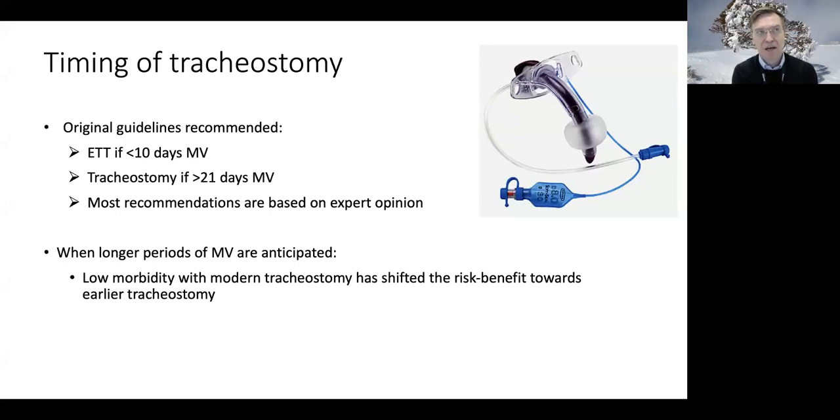And I think our practice has come to reflect that this is really a very individualized consideration for the patient that you're actually caring for at the time, and to be guided by expert opinion and experience, and try and tailor the approach for the patient. Certainly when a longer period of mechanical ventilation is anticipated, then modern techniques of tracheostomy insertion are very safe, very well tolerated, with very few risks to a patient. And I think for many patients, the balance of risks favours early tracheostomy under many circumstances.